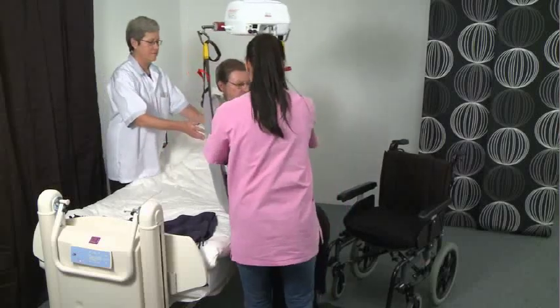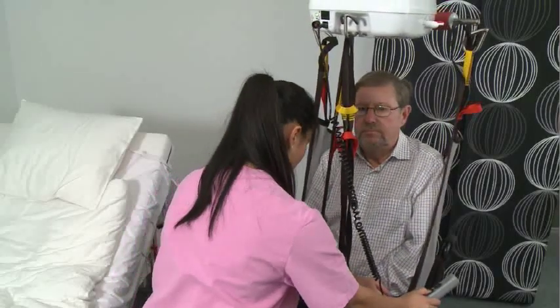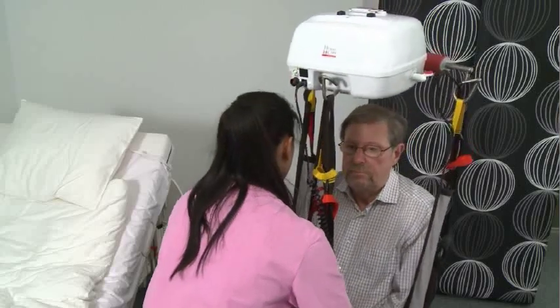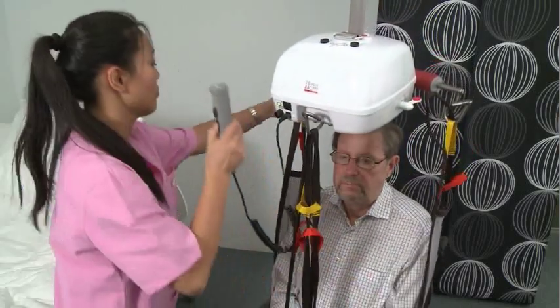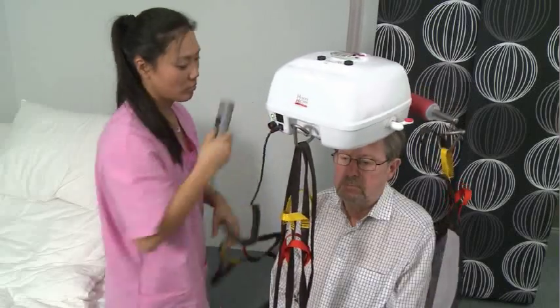The red telescopic spreader bar has three alternative width settings. In this demonstration it is set to a medium width of 45 cm. The client's position can be further adjusted by choosing the alternative black, yellow, or red strap loops.